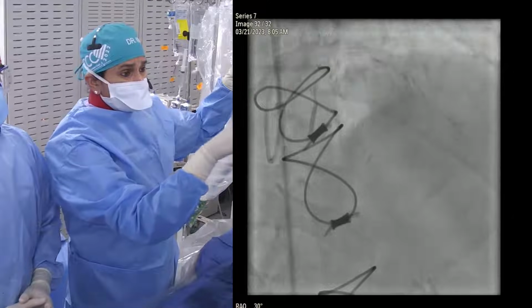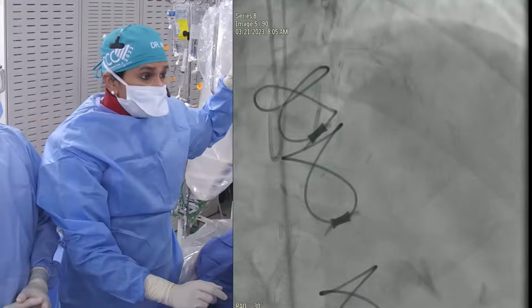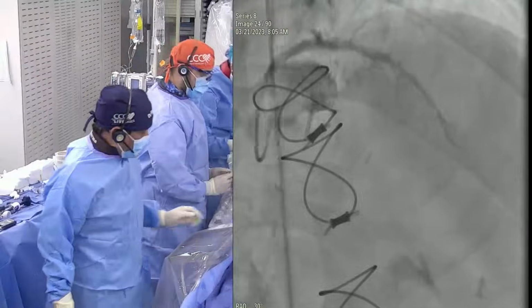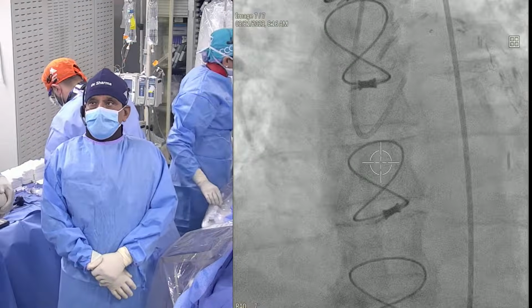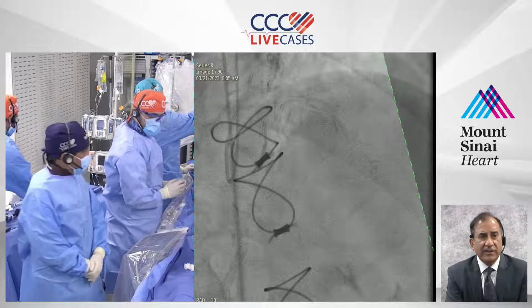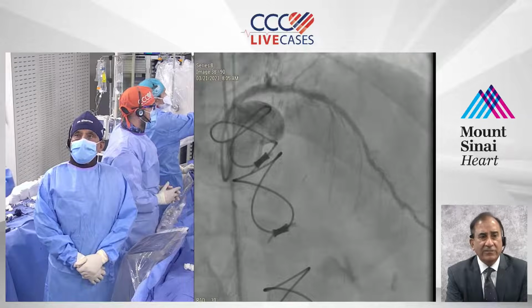In this view, you can see the LAD stent is underexpanded. Yes, clearly, the LAD stent looks underexpanded right there, and at 12 o'clock, when you inject dye, there is stenosis. I think there is going to be both: instent restenosis as well as the problem of the underexpanded stent, which I think created it. But I think you're absolutely right, on the angiogram the left main does not look too bad. Hopefully, the imaging will clarify that.